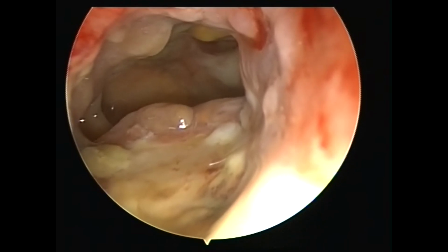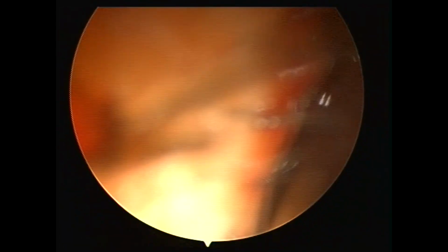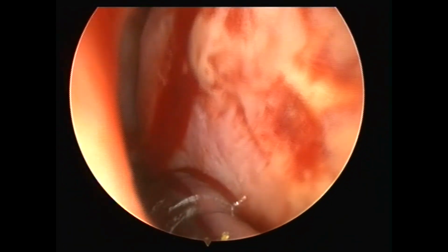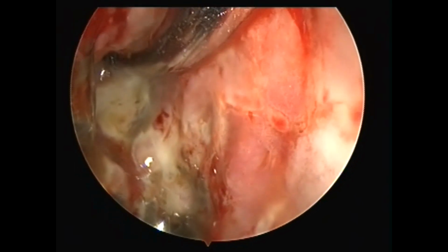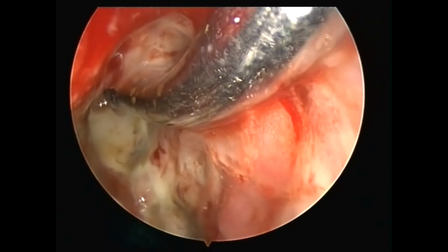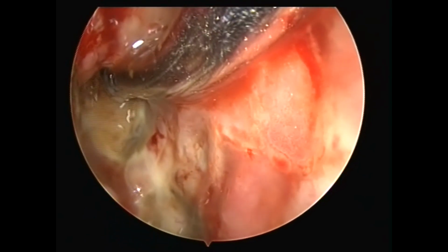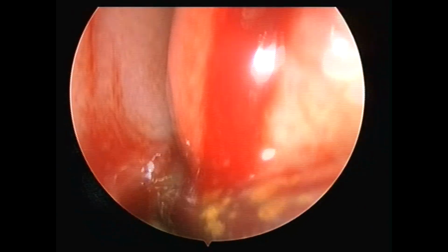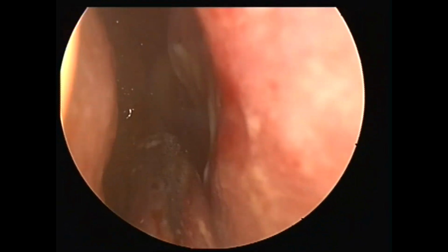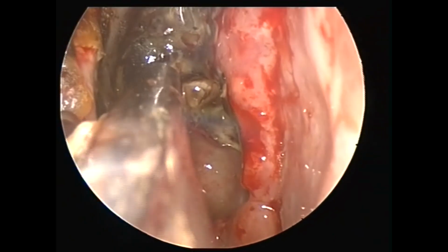I'll also show you the pics of the external frontal sinus glow at the very end of this video, but you can see I'm now trying to give a wash in the patient's right side frontal sinus. This is the maxillary curved suction I can use for both maxilla and frontal sinus wash. You can see, now I'll even show you a better way of doing a frontal sinus wash. I'll explain how you can do that.